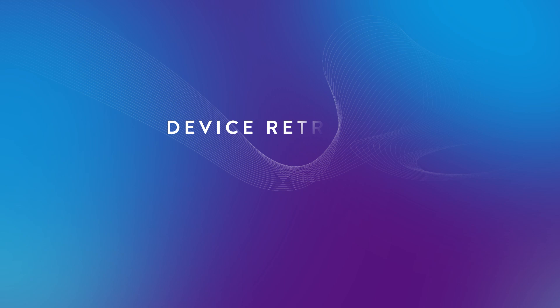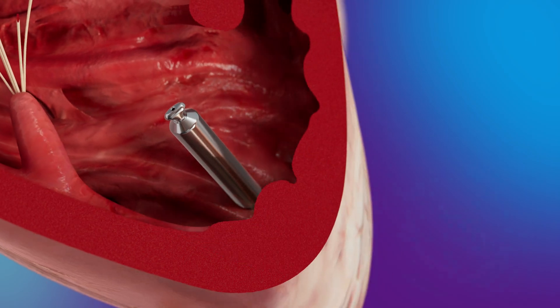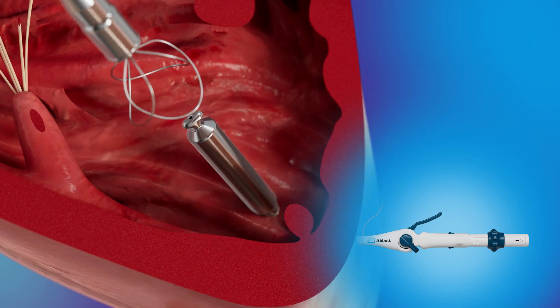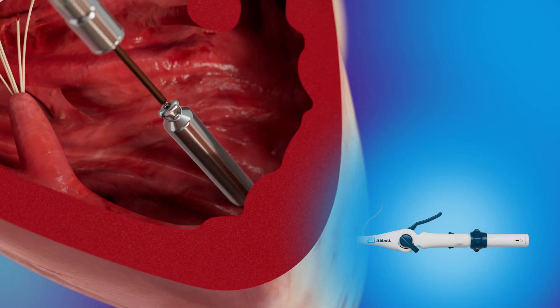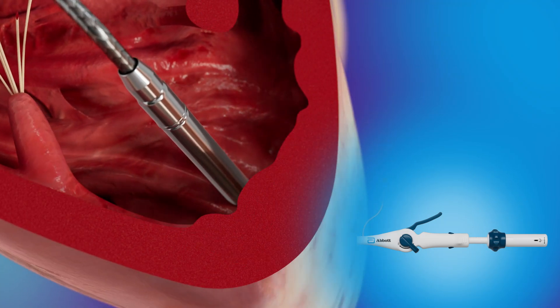To acutely or chronically retrieve an implanted LP, the dedicated retrieval catheter can be used. During a retrieval procedure, the retrieval catheter is advanced into the RV, aiming for the LP docking button. Once positioned, the snare is closed around the docking button and locked into place using the snare control knob. The LP is then docked to the retrieval catheter and covered by the protective sleeve.